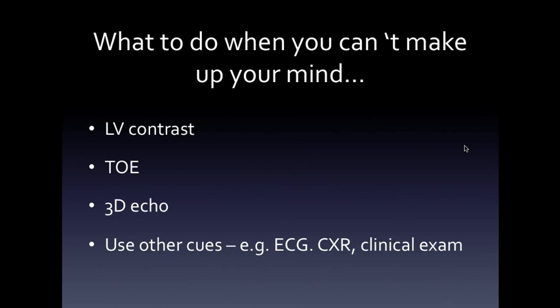because of the technical differences in frequency of a transesophageal probe compared to a surface probe, and because now our machines are so clever, they'll automatically change things like the pulse repetition frequency, the PRF. So if you have a patient and you see a lot of mitral regurgitation on a transesophageal echo, that may be entirely artifact because the PRF was changed automatically by the machine because it's a higher frequency probe.